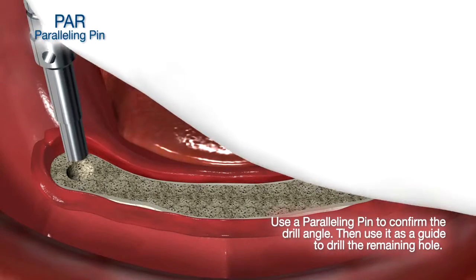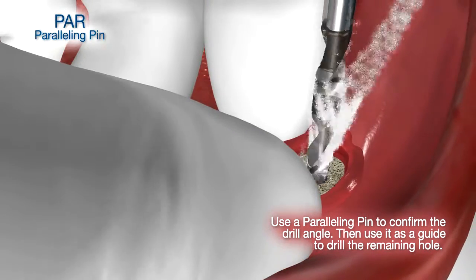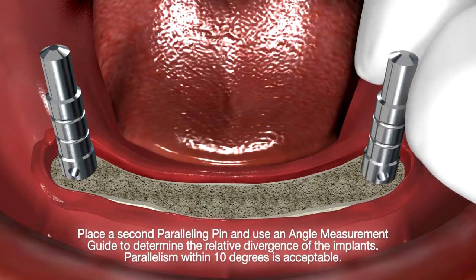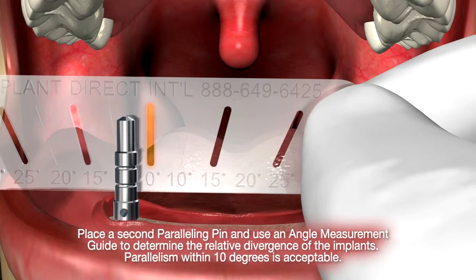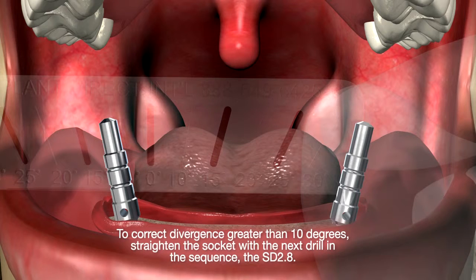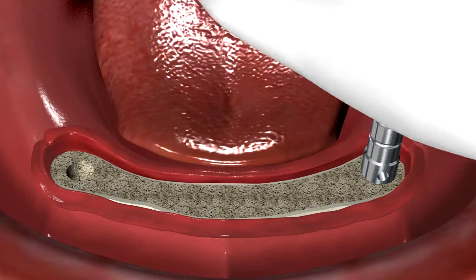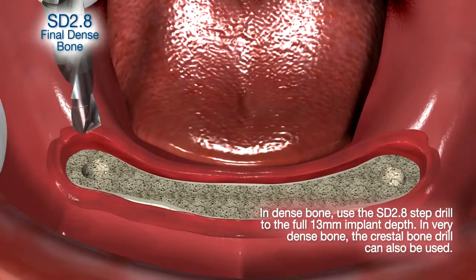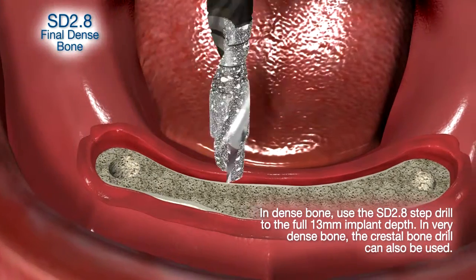Insert the paralleling pins. Use them to align the other implants, just as you're paralleling preparations in the mouth. They need to be within 10 degrees of parallelism. If they're canted out, straighten them up with your next drilling procedure. If you're going back with a 2.8 drill in dense bone, you could use that to straighten up those sockets. The attachments will work with 10 and 10, which is 20 degrees divergence, but there may be more wear on them, so it's easier to just get them parallel.